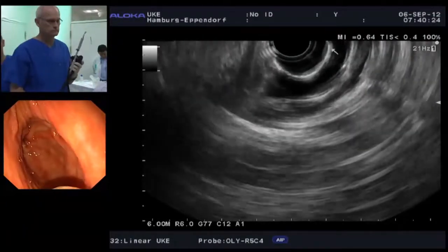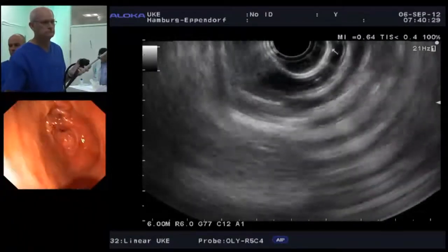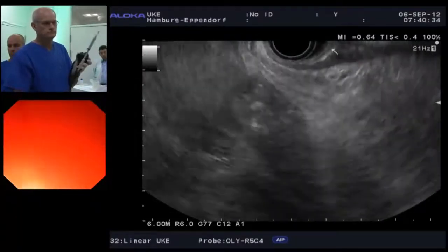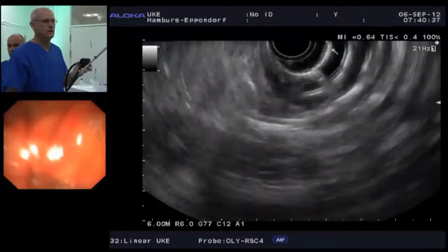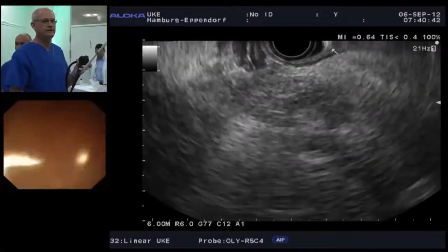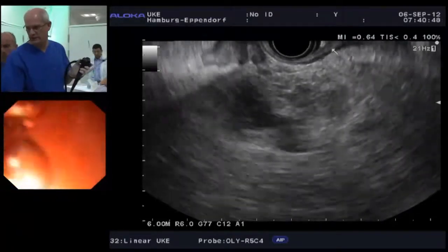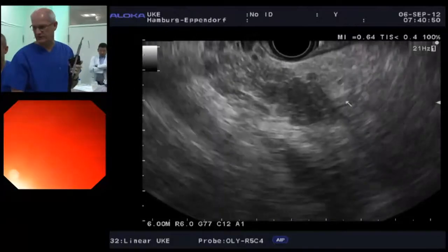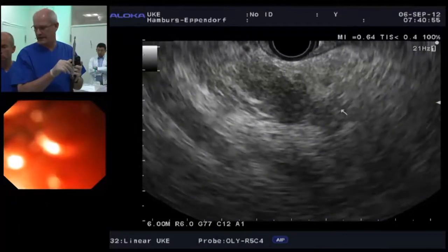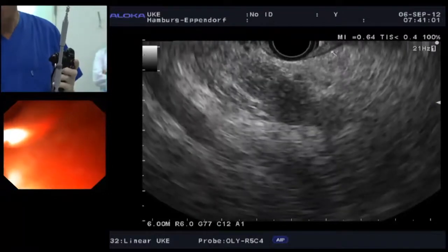I know we'll be hearing a lot about the different needles from Professor Ginez later on in the course, and also about echo enhancement from Dr. El-Abadi later in the course. So we'll focus on today's case of the FNA and how Rob's going to perform that. Right, I think it's a good discussion, Mike, and I think contrast agents do have a future. I'm personally not sure that they're ever going to be a substitute for histology, which is my main issue. But anyway, we're going to get started, Mike, and you'll see the needle come out here.